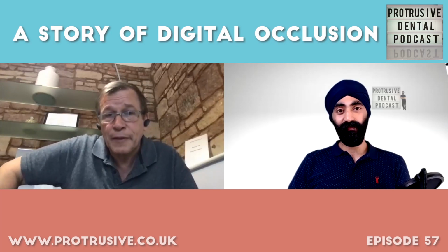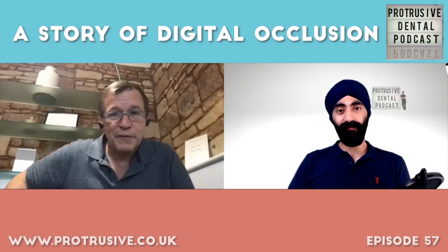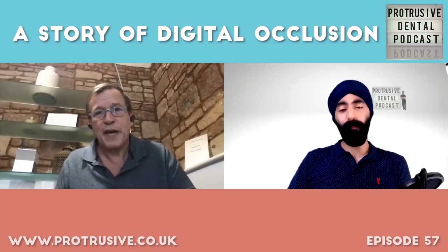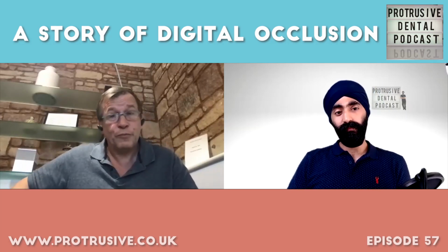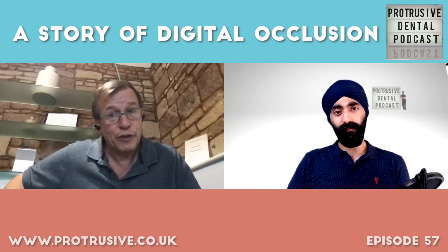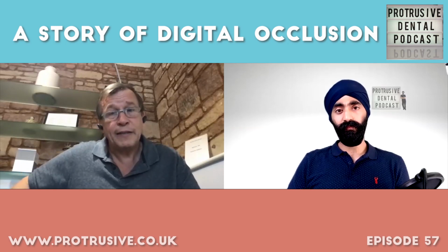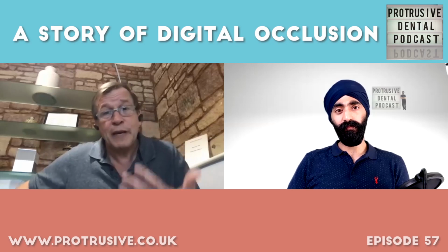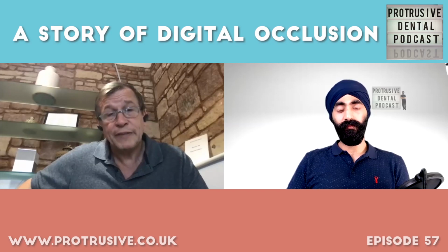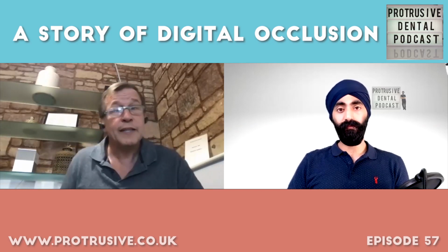Now, there are times, and the key is to understand when those are, when we might need a little bit more information. But to come back and say, okay, what's your protocol, Ian, for records for smile design, full mouth rehabs, comprehensive patients? Well, so we do our complete examination. We do photographs. We talk to the patient about what's there in the terms that they would like to receive it. And then if they're motivated from the aesthetic perspective, then we'll show them a 2D smile design, and if they're then motivated to spend that, let's say £200 on their smile design, then we'll move forward with that.